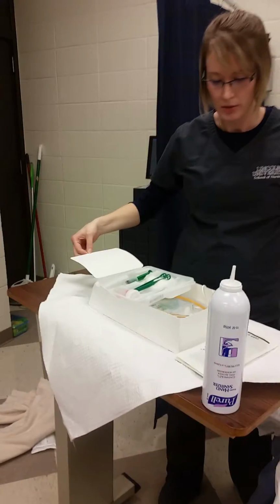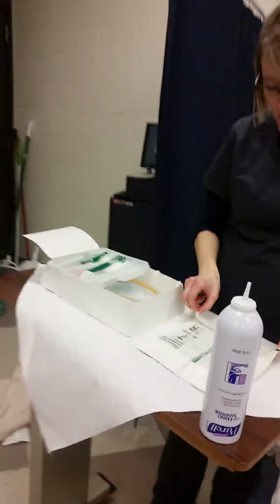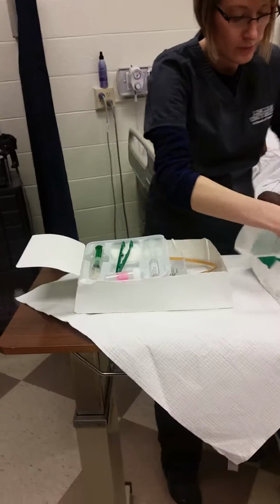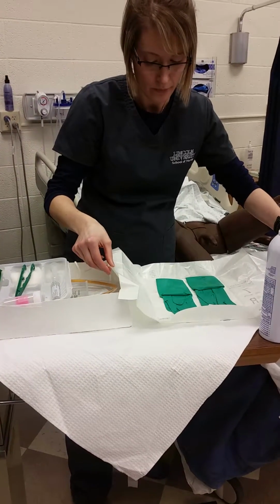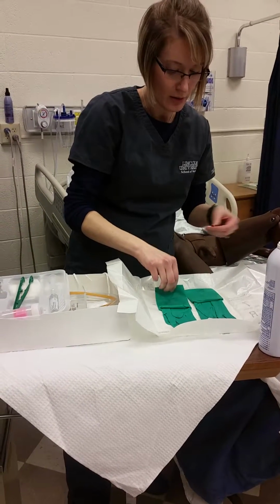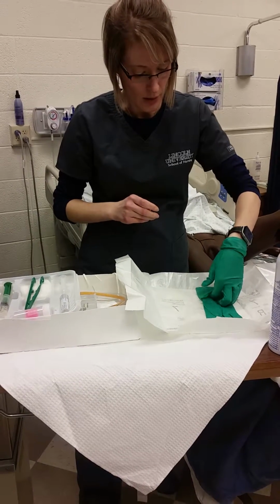I would then take my catheter kit, grab my sterile gloves out. I'm going to open these up, only touching the 1 inch outside perimeter. These are turned around backwards. Open them up. Put the non-dominant hand on first. These are backwards in the package, but non-dominant hand on first. And then the dominant hand.